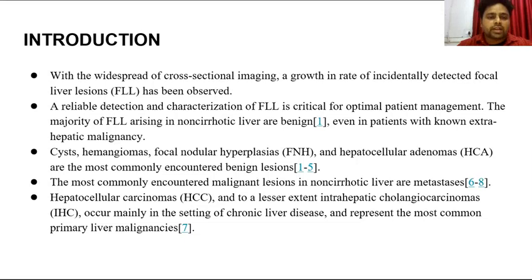Introduction. With the widespread use of cross-sectional imaging, a growth in the rate of incidentally detected focal liver lesions has been observed. A reliable detection and characterization of focal liver lesions is critical for optimal patient management. The majority of focal liver lesions arising in the non-cirrhotic liver are benign.